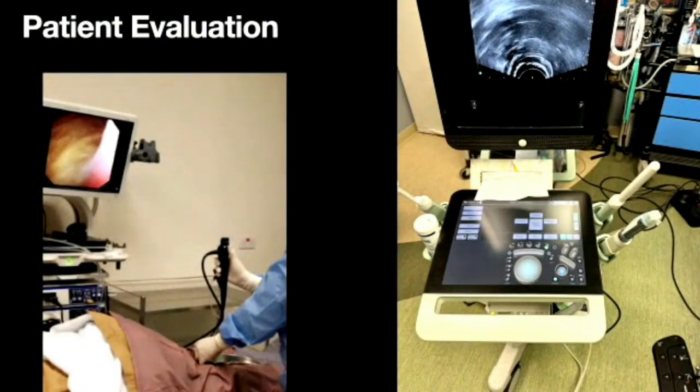One thing I forgot to mention when talking about Rezum is the pre-op evaluation. Most patients are going to go through a couple of procedures in the office before having this done. The one on the left is a flexible cystoscopy — we talk about that in episode five — so the doctor wants to look inside and see how the prostate looks from the inside. On the right side we see the transrectal ultrasound, the same machine we use for prostate biopsies, placed inside the rectum to take an outside picture and measurement of your prostate. There are some parameters we have to look at to know what procedures will work for you — these are all custom procedures per patient.